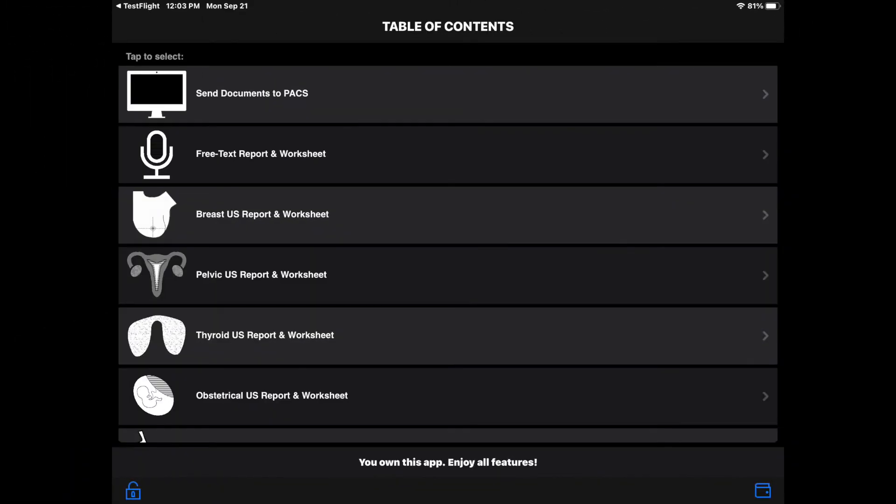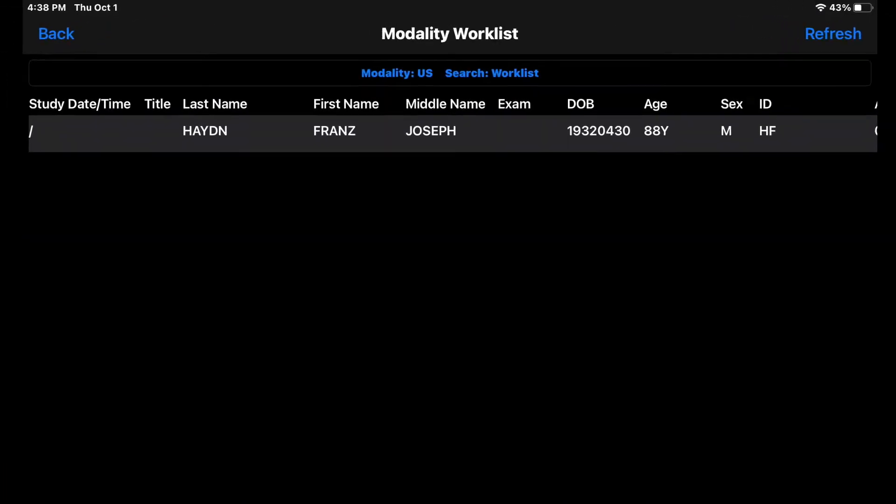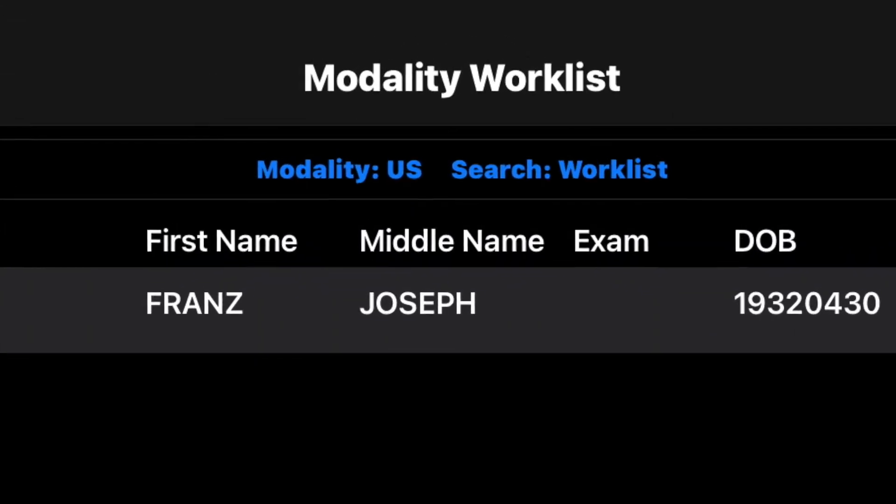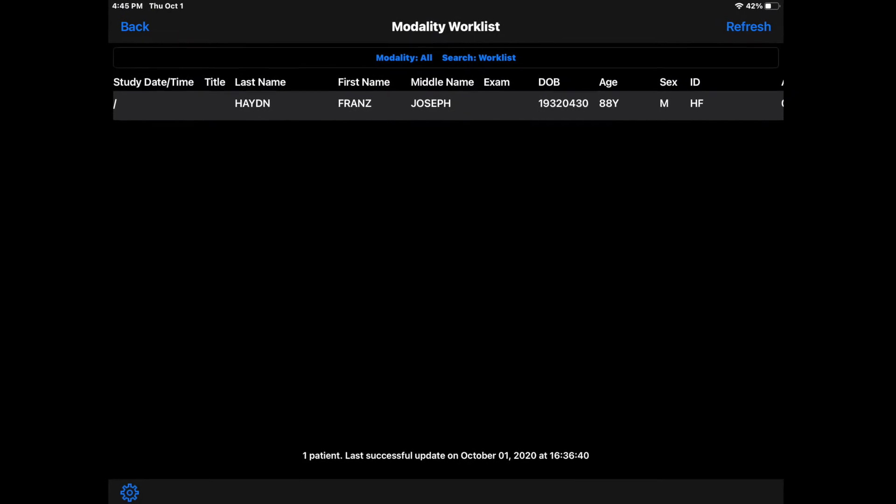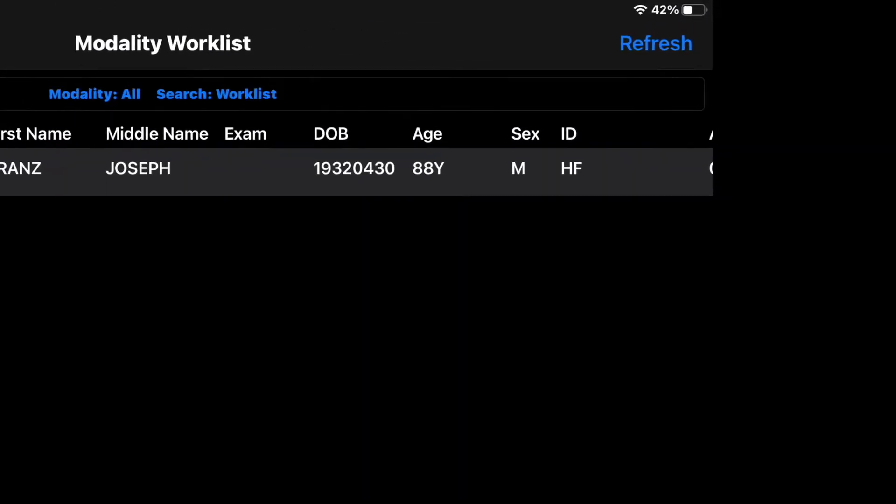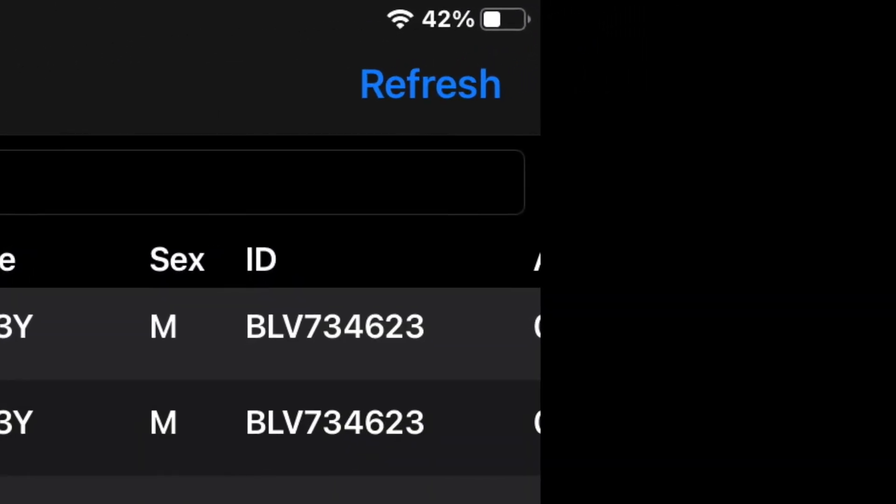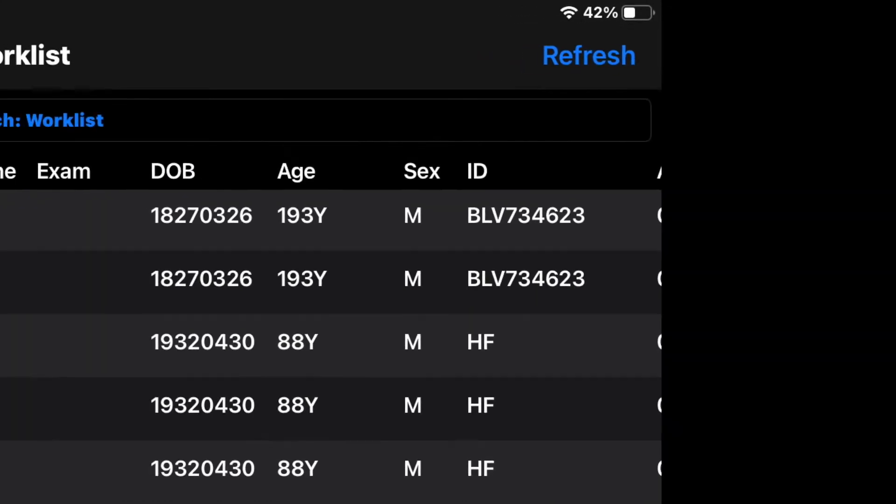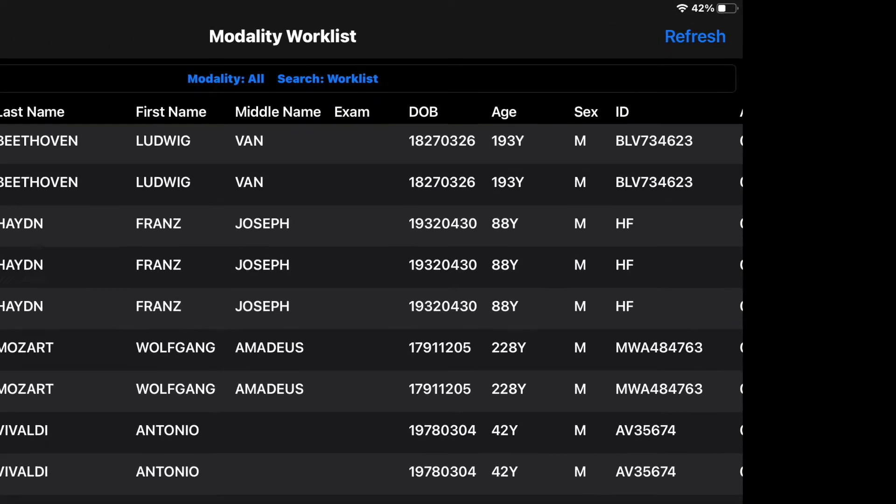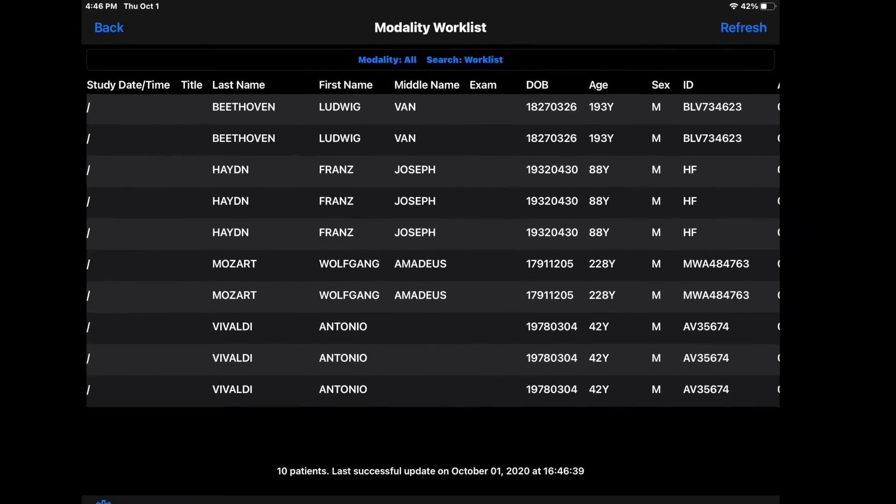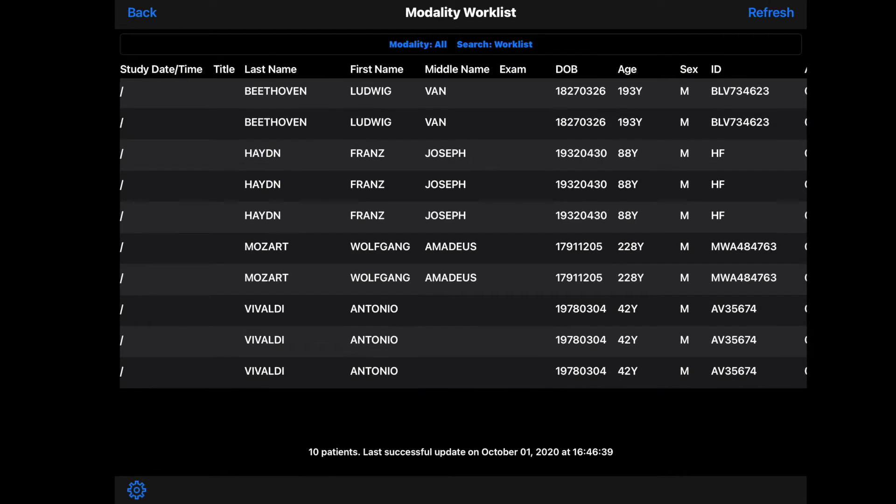Select one of the topics and then tap on Modality Worklist or MWL. You can modify the search by tapping on the Modality Search field and changing the selection from the wheel. Tap Refresh or swipe down the table to refresh the modality worklist. If you have set up the DICOM settings correctly, you will see the list of patients for the selected modality.